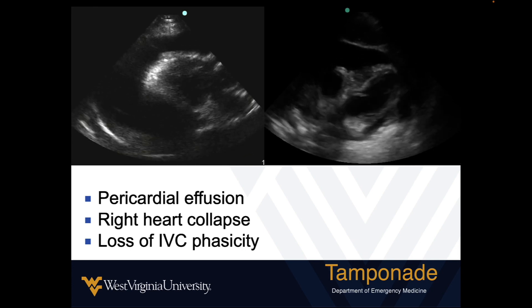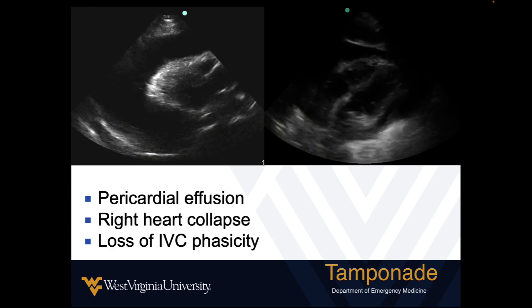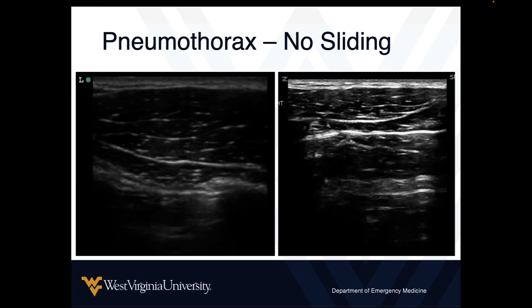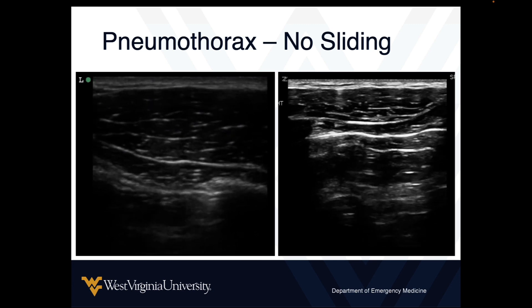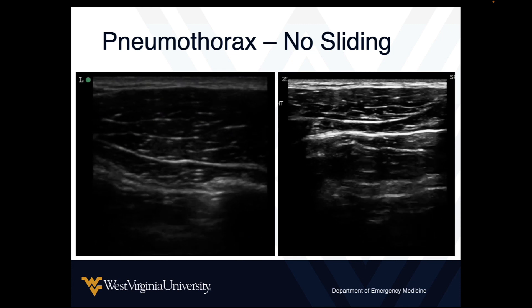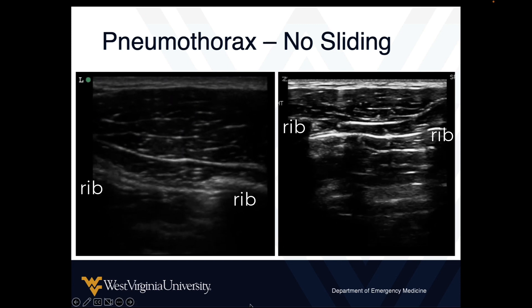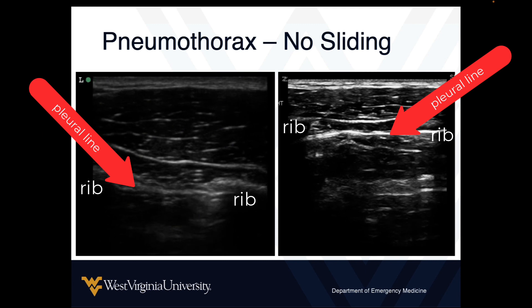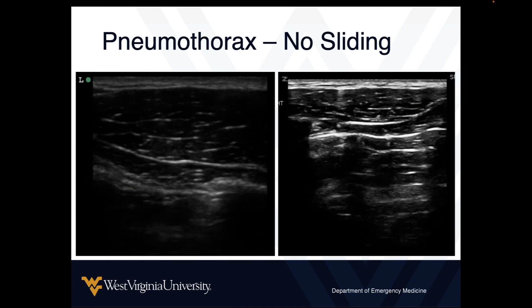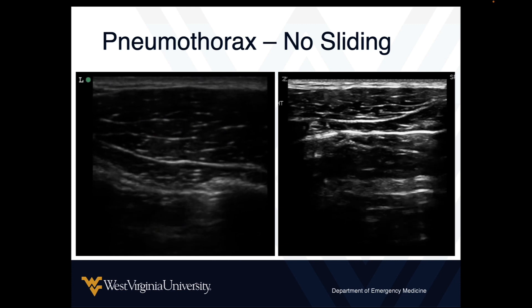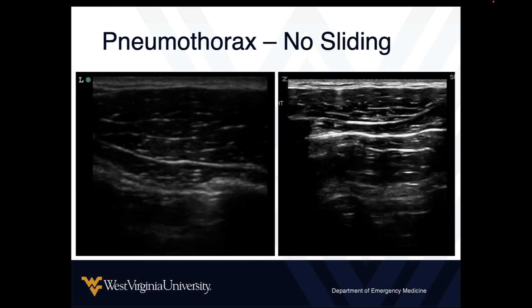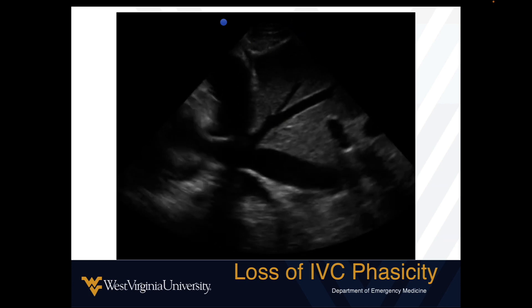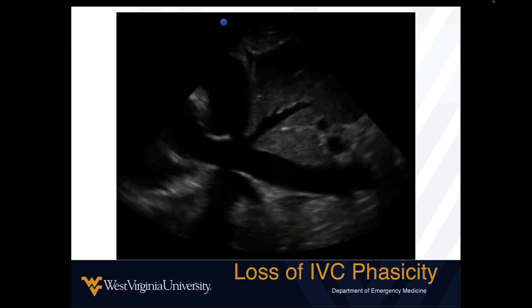In cardiac tamponade, you should also typically see loss of phasicity in the IVC — the opposite of hypovolemic shock, where the IVC is collapsed and compressible. Tension pneumothorax is another etiology of obstructive shock. Looking at the lungs, we see ribs with shadows, and along the pleural line we should see pleural sliding — but here we see absolutely none. If a patient is in shock and we don't see sliding, it's not a bad idea to decompress the chest. All forms of obstructive shock generally increase right atrial pressure, which transmits into loss of IVC phasicity.